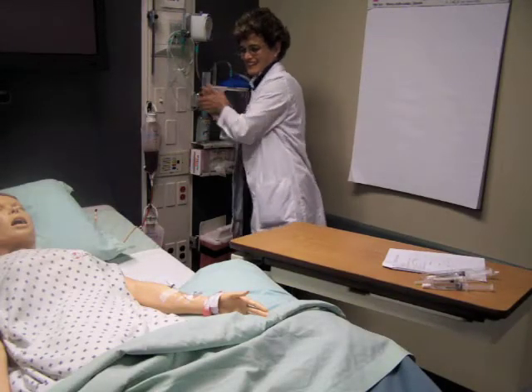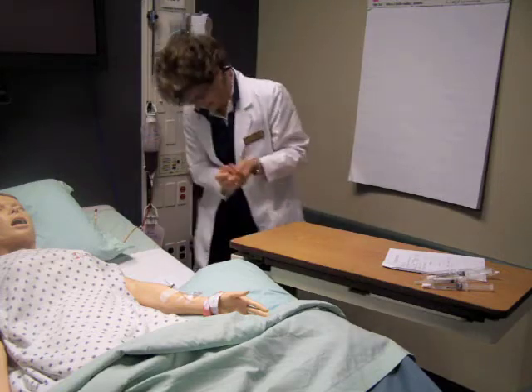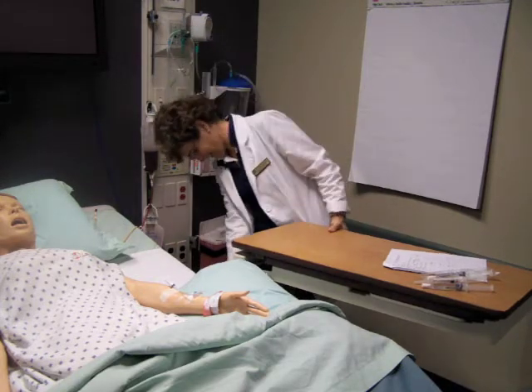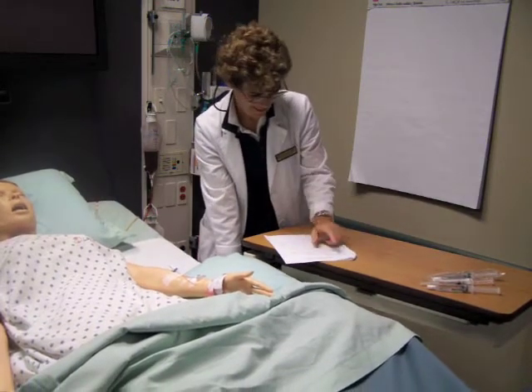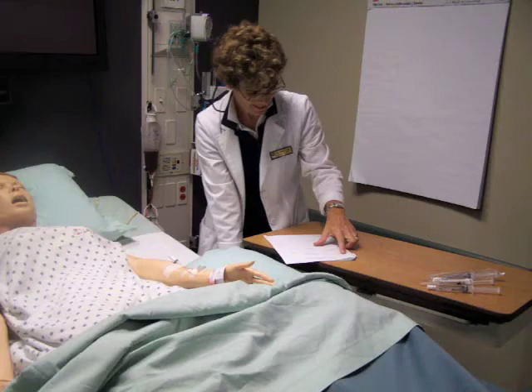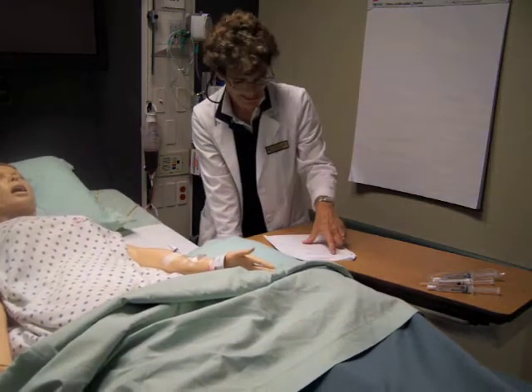Implementation. Perform hand hygiene to minimize the risk of nosocomial infection. Your nurse today is taking care of you. Identify the client by checking the client's identification band using 2 identifiers. This ensures that the right client receives the correct medication.